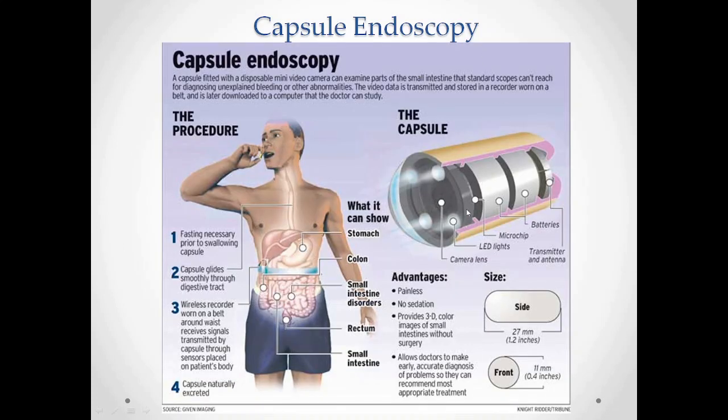Now you see the picture of the capsule endoscopy. This is a picture wherein you see a person undergoing the procedure, and definitely you need to have fasting before the endoscopy because you swallow a tablet. The tablet with a camera travels through the food pipe, stomach, intestine, etc. So it has to be clear so that it takes a clear image. So you have to be fasting on the procedure day.